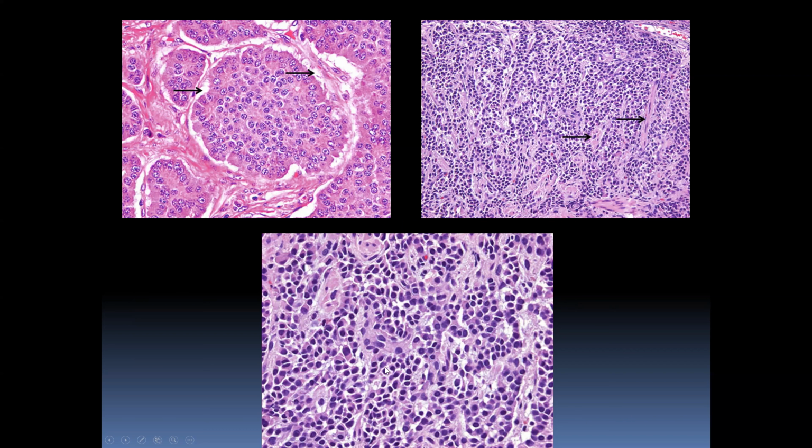Occasionally, you get sort of this plasmacytoid appearance that you can see in some of these cells where the nucleus is pushed off to the side, and they resemble plasma cells, particularly because they have that eccentric nucleus and a fairly uniform chromatin. What you will not see, however, usually is a perinuclear hof as you do in plasma cells.